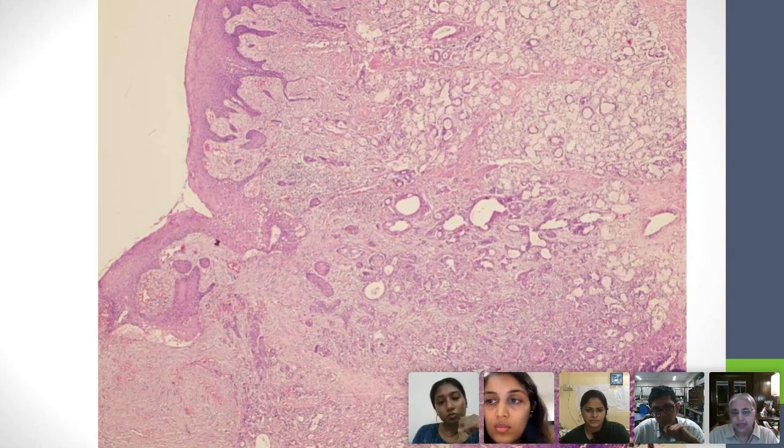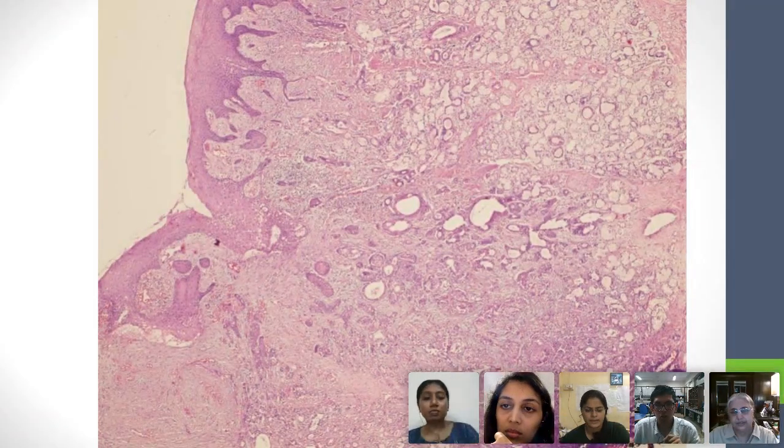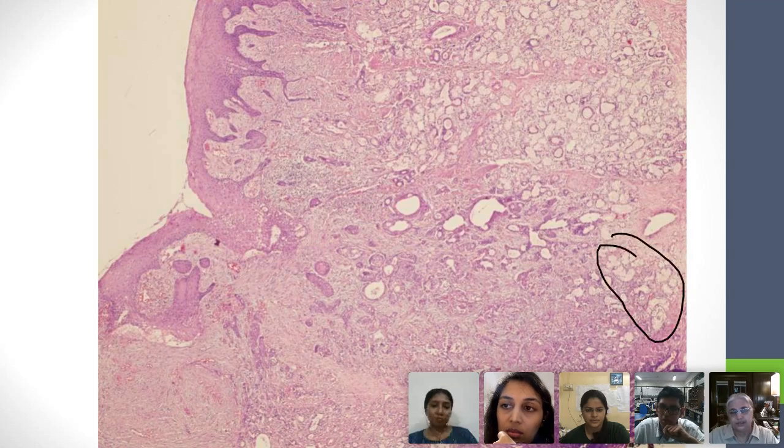And then you see something else, my dear Ashish. Here, ma'am, in the region of this abnormality, I'll just mark it. In the solid region of this abnormality, what else do you see? Do they look like ducts to you now? No, ma'am. No, what are they?